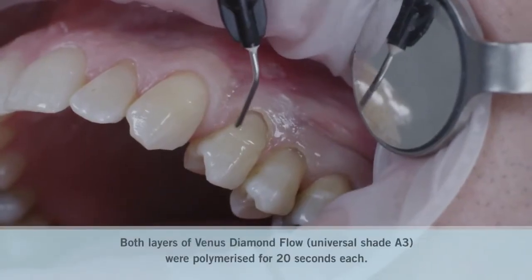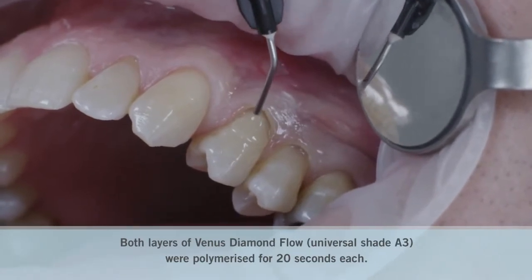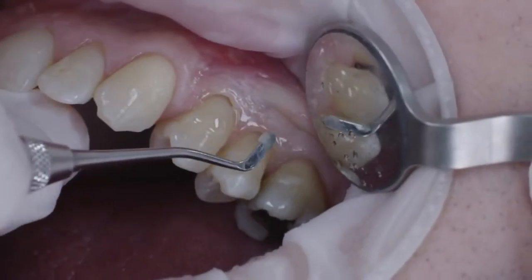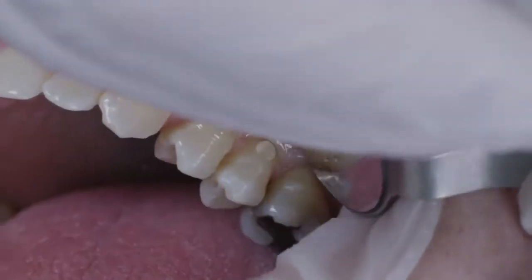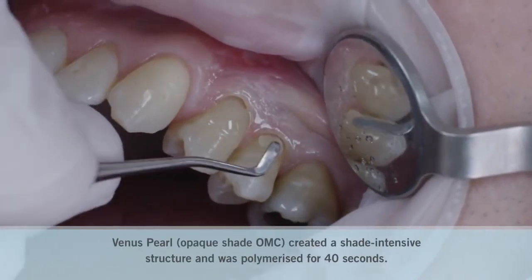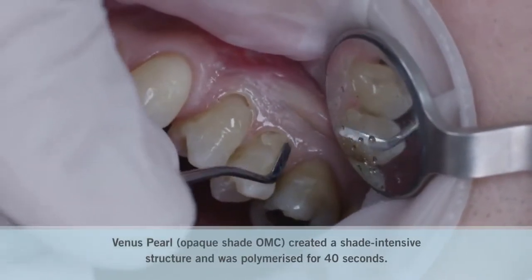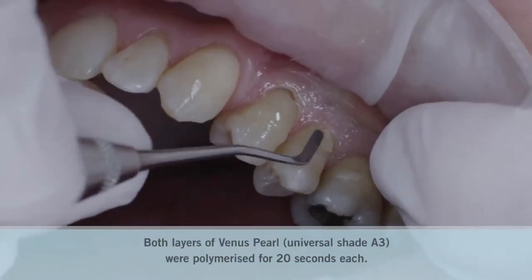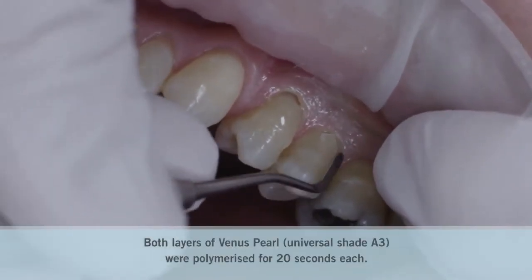For final modeling, I once again used A3 to cover the entire cavity. For tooth 2.5, I used the nano-hybrid composite Venus Pearl. Here, the opaque shade OMC was also placed at the center of the cavity and slowly adapted to the margin. The tooth was built up with two layers of A3 and the filling completed.